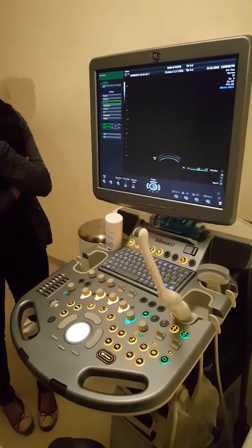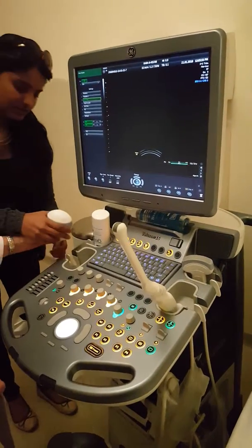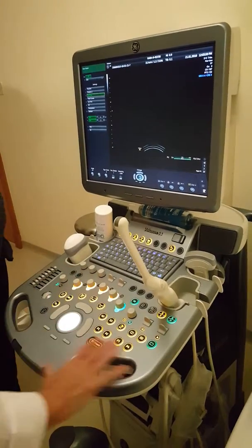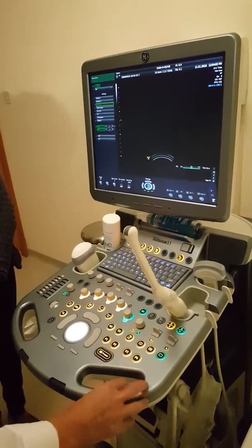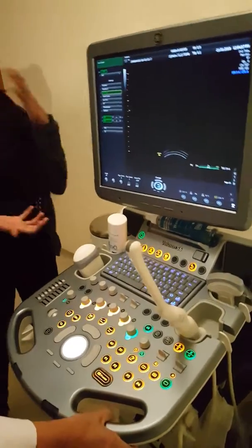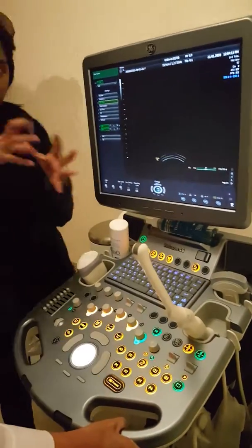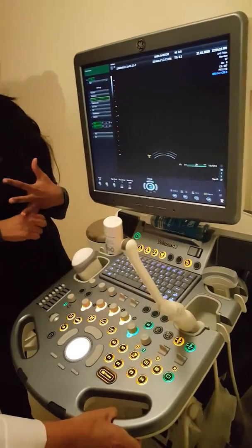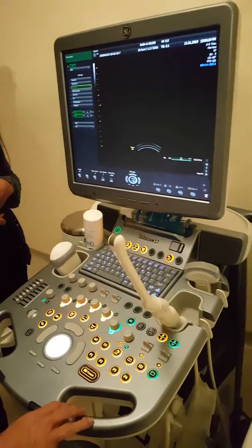And then you had all the tips, because I did forget some. Sorry, that's just the buttons. When do you use the archive? Always. Archive is used whenever you want to retrieve your images back. Whatever you're saving here, if you want to retrieve it back, you want to look at it. Even after a long time? Yeah, of course.